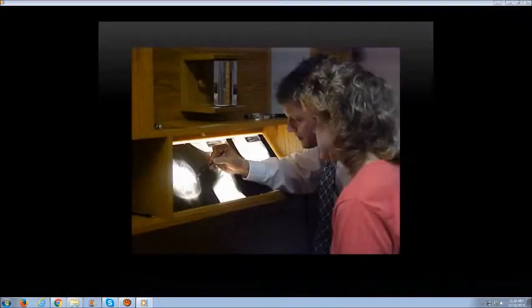In this presentation, we're going to be talking about how to mark the base posteriors, and then we want to look at this. You see where the external orbit of the eye, internal orbit of the eye. So on this one, when I take it through, I'm going to have the patient lined up. I'm going to turn them to the left at 27.5 degrees.